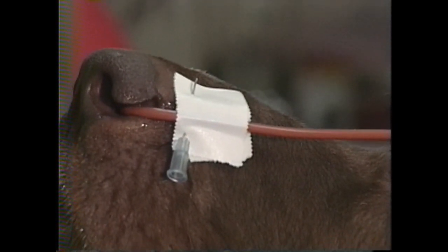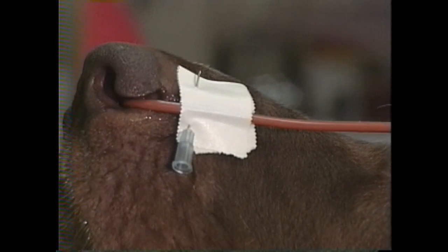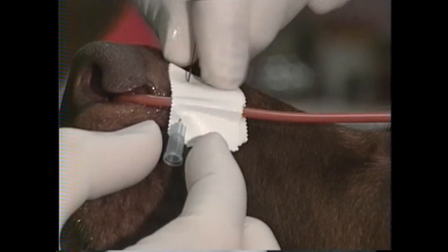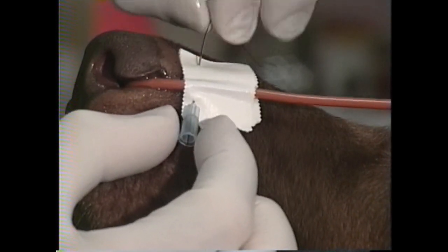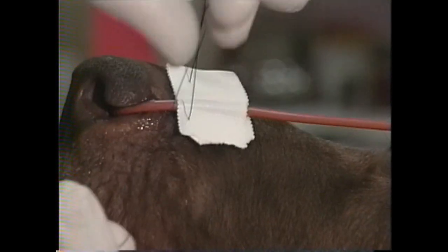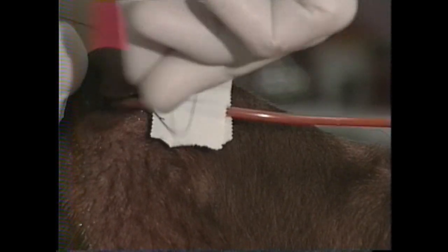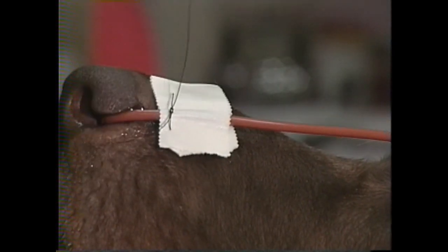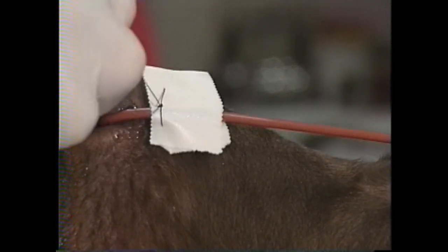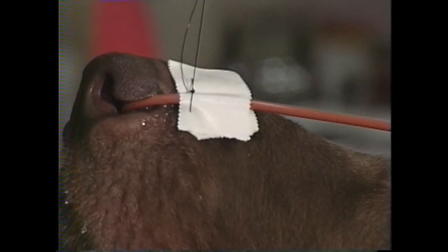The suture has to be passed through the bevel end of the needle — you can't pass it through the luer end. That end doesn't act like a funnel; it acts like you're trying to hit a target at the bottom of a deep well. The suture fits snugly but it does fit through a 22 gauge needle. We'll pass it through and then tie this snugly but not tight — you never want to make this so tight that it damages the skin. Cut that short.